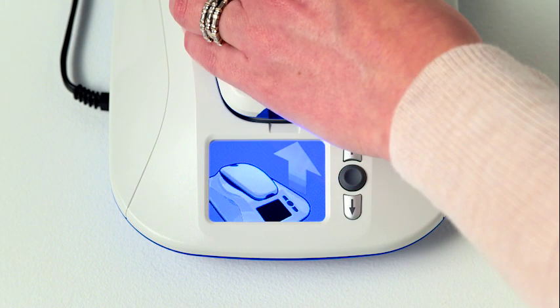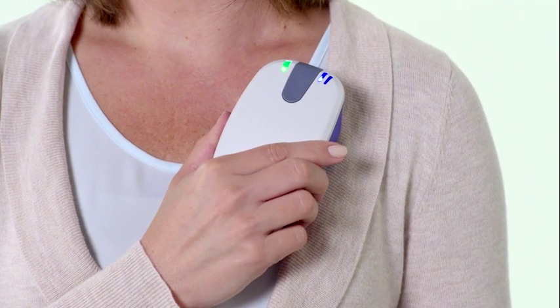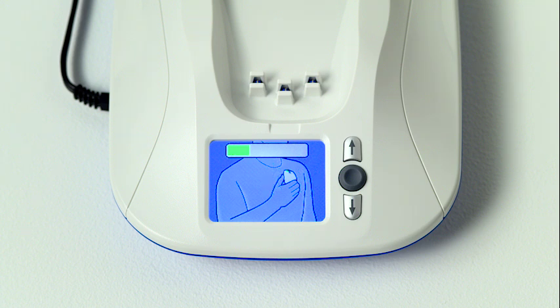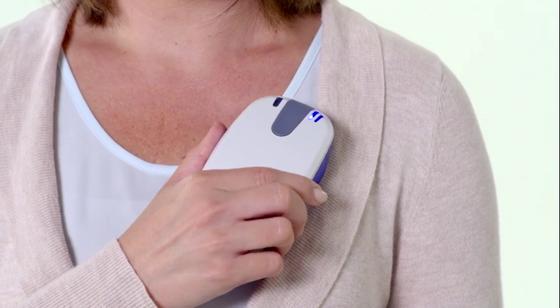Now, remove the reader from the top of the monitor and place the reader over your heart device. The green bar lets you know that the reader is positioned correctly and reading your device. If you see this on the screen, it's telling you to reposition the reader for better information gathering.